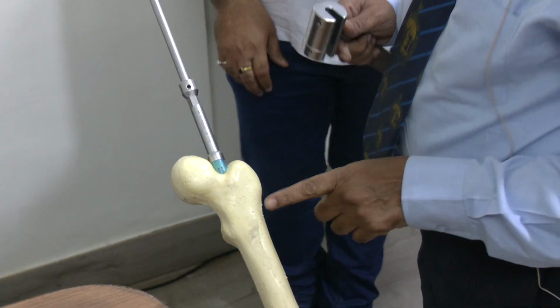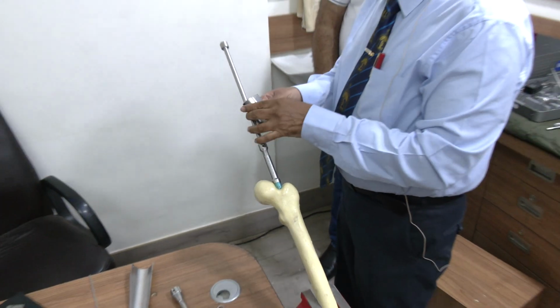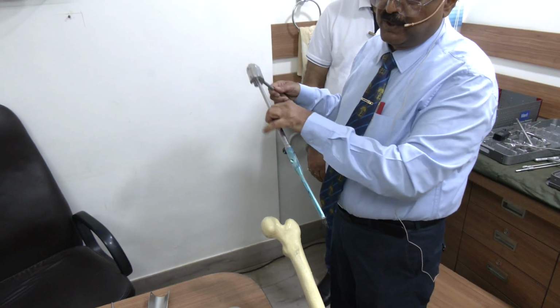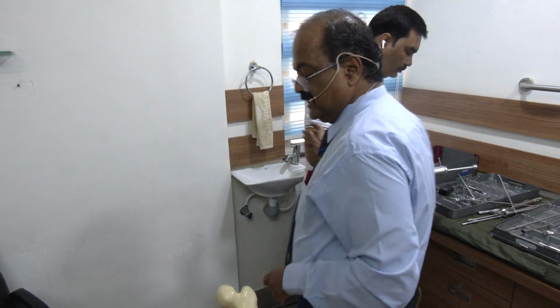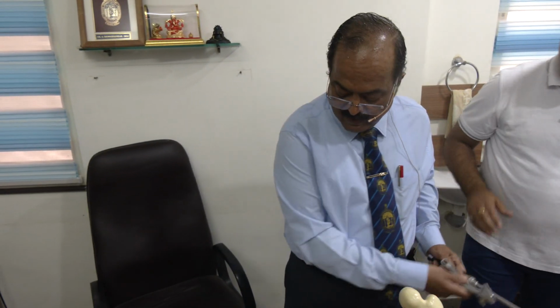So now I have extracted the neck screw helical blade as well as the locking screw. I can extract the nail in this fashion, which comes out. So this is about the technique of doing the surgery. I think I have shown all the instruments while doing the surgery itself, so I don't want to further take up your time.